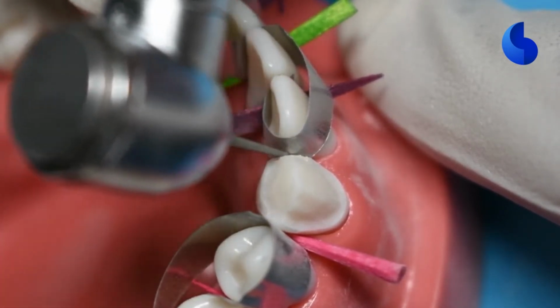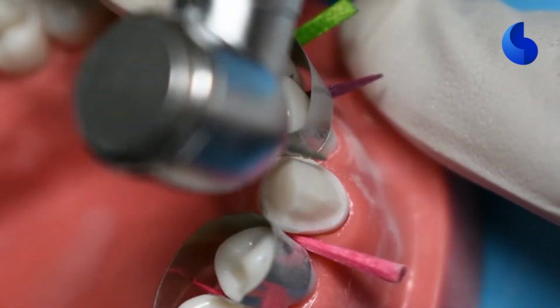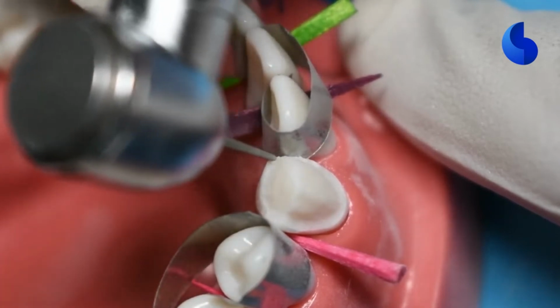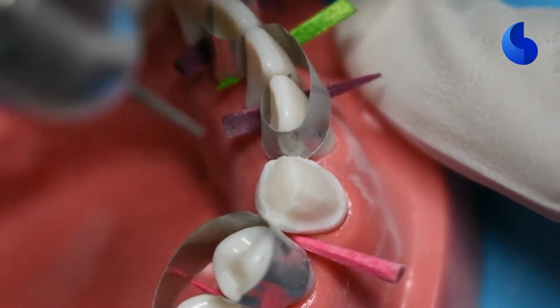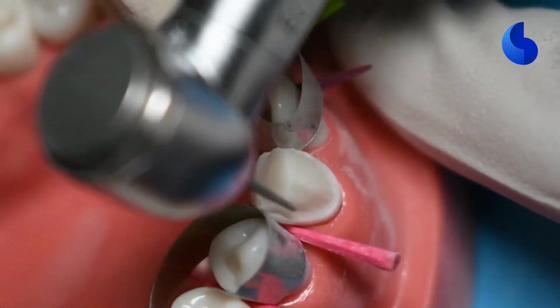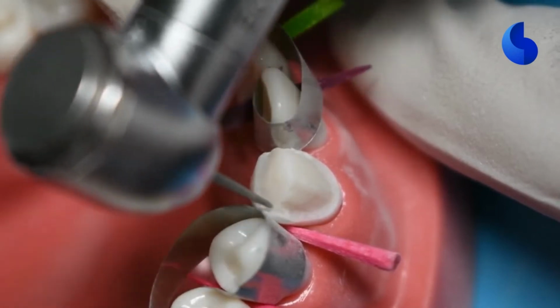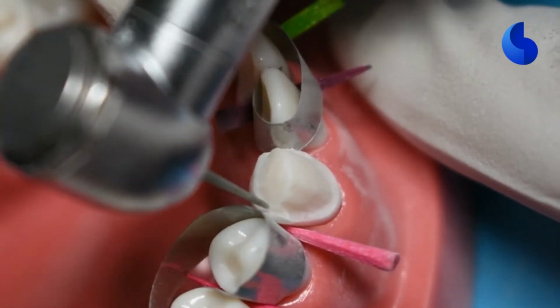You can leave a shell of enamel while you're doing it, and you can also use a matrix band and wedges like we've used here, or you can also use fender wedges, which are wedges that come along with a matrix band attached to them, and this helps to protect your adjacent tooth structure.